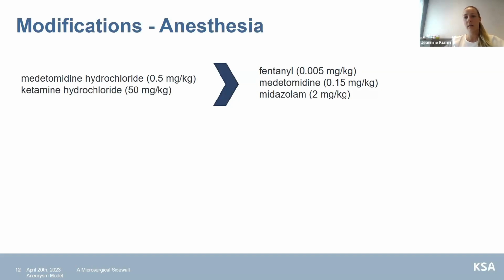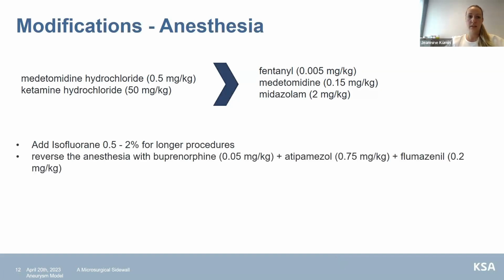But since the procedures got a bit more complex with all the modifications, we had to change the medication to a mixture of fentanyl, medetomidine, and midazolam, and added isoflurane for longer procedures. This has the benefit that we can reverse the anesthesia by the end of the surgery.